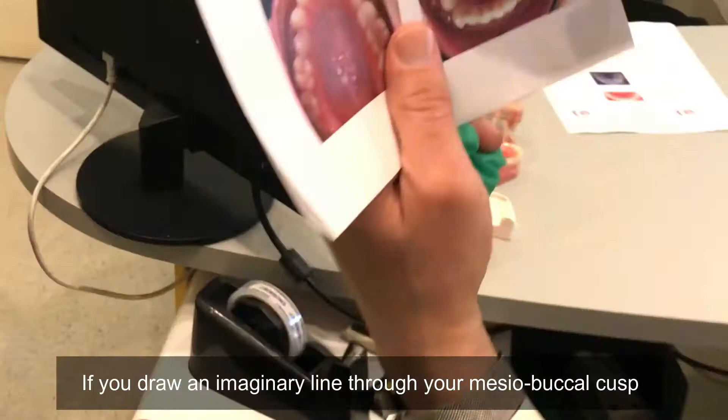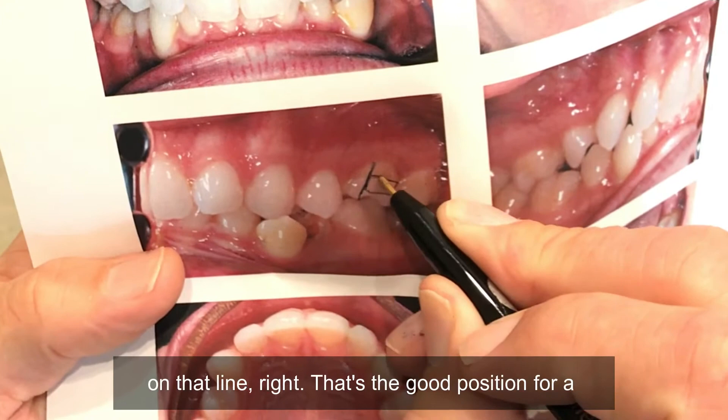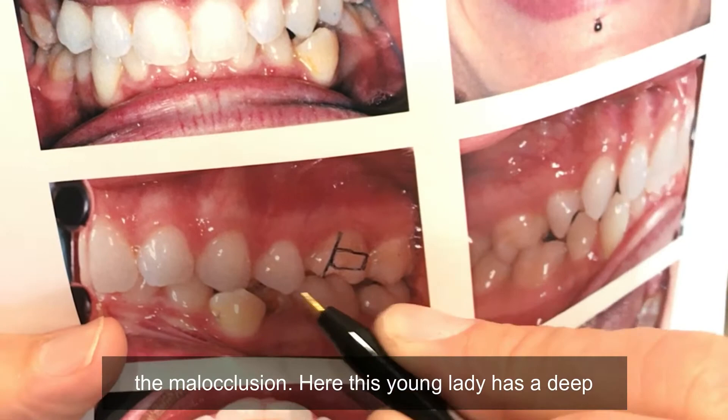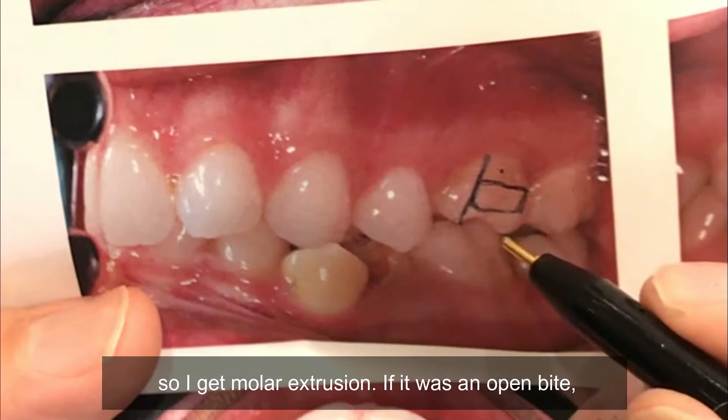Now where should you bond a molar tube? If you draw an imaginary line through your mesiobuccal cusp, the opening of the molar tube should be on that line — that's the good position for a molar tube when it comes to mesiodistal. When it comes to the vertical, it depends on the malocclusion. Here, this young lady has a deep bite, so I'm going to bond that more gingival so I get molar extrusion.